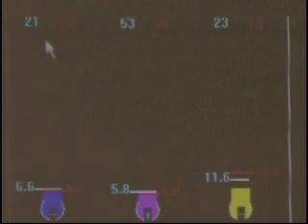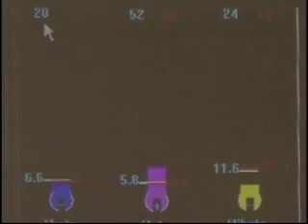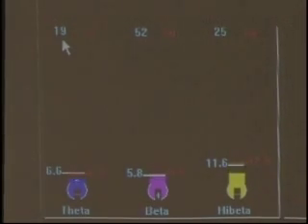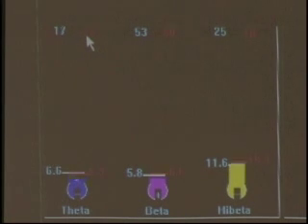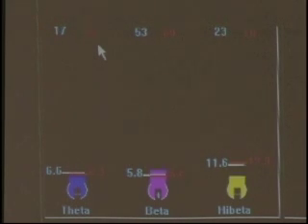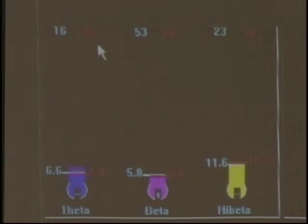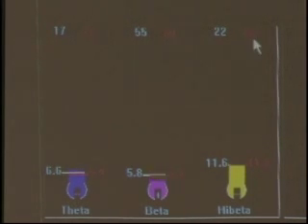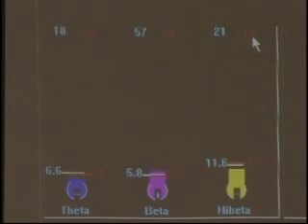Looking at the numbers — I see a fluctuating value around 21-20. The blue number is changing while the red number is fixed. The red number represents the percent time over threshold that we preset. Remember that 20 on a stop. Moving over to the go, we see 60 — 60% time above threshold. High Beta has its own setting because it's more of a guard band; we set it at 10.